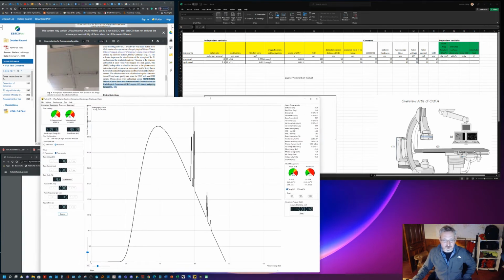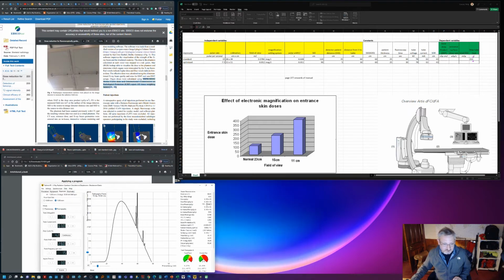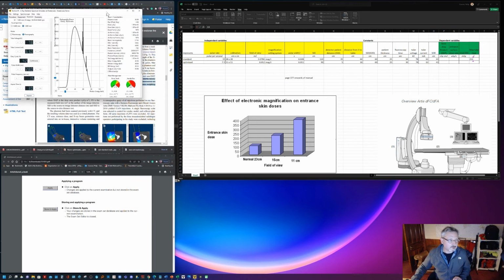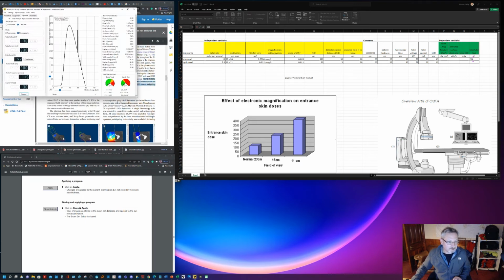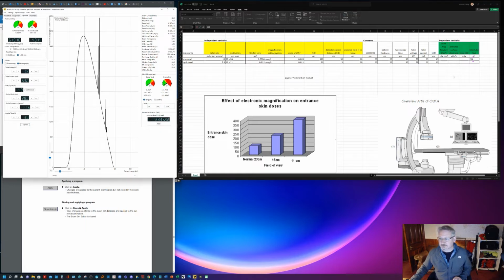So what we're going to have to do is minimize this down, and we'll have to write the numbers in here. So the maximum heat was 214. In fact, what I'll do is put it over to the side here, cover up the paper. (214°C).